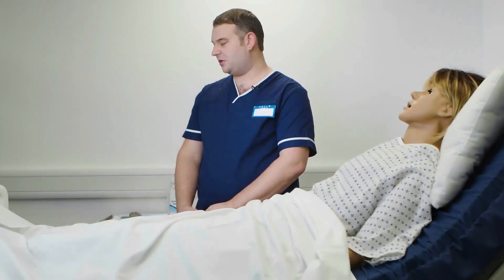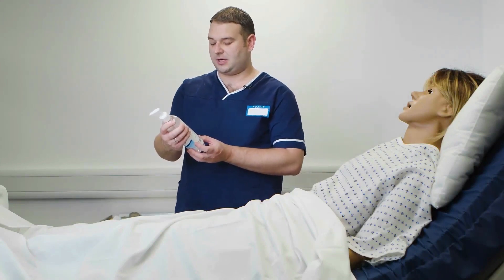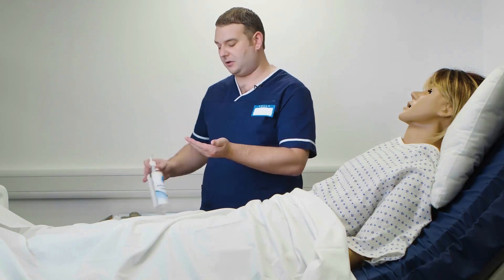Next we will perform hand hygiene, but first we will check the alcohol gel — the expiry date — and it is in date. We will now perform the seven steps of hand hygiene.